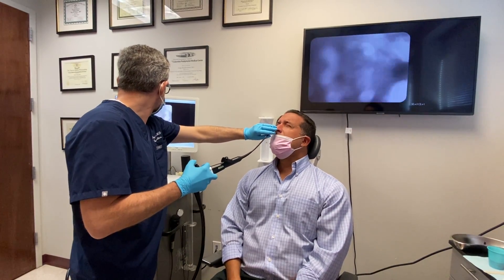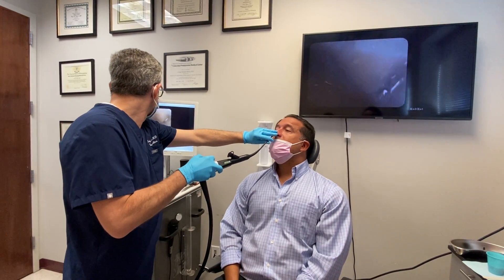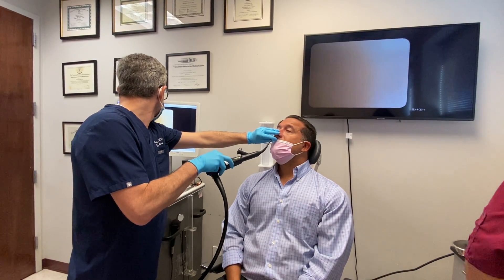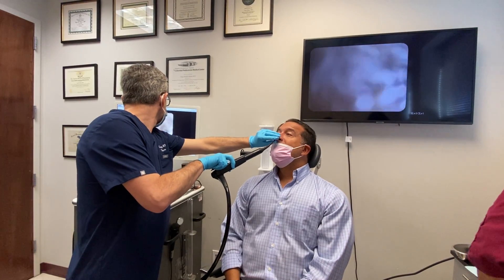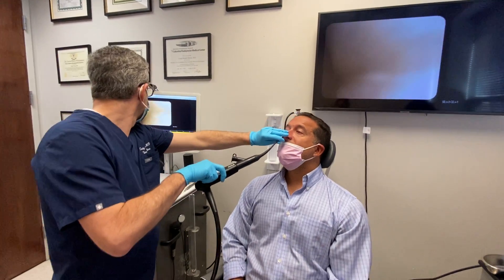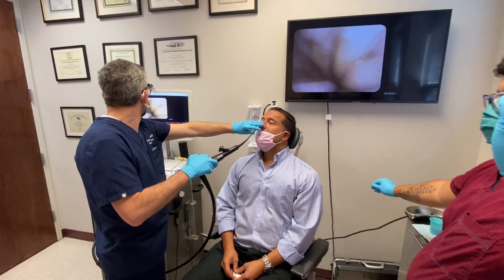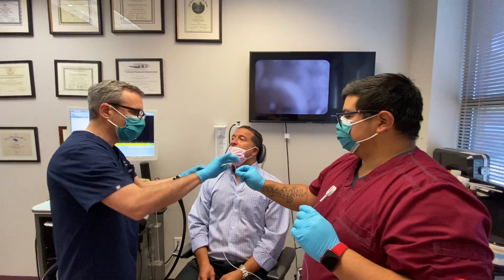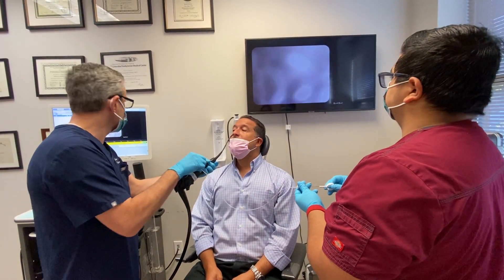You're doing great. Just breathe slowly and gently. You may feel a little pressure. I'll take a little brush. So what I'm going to do is take a little sampling of some of the cells that are down in the lower esophagus, right before it turns into the stomach.